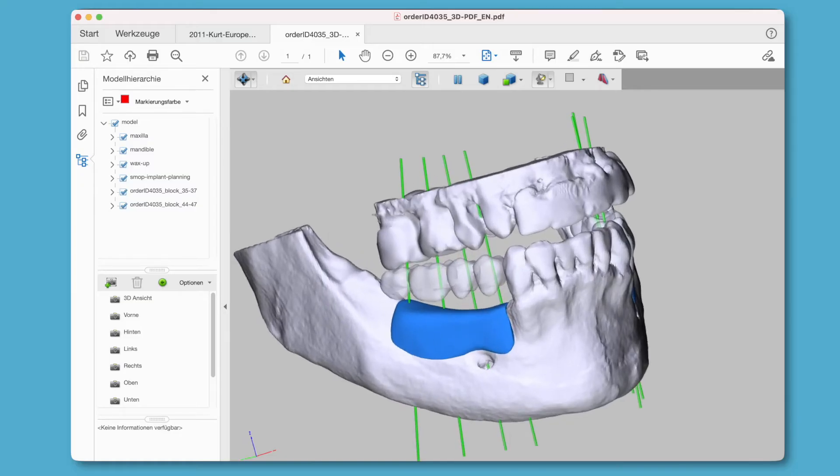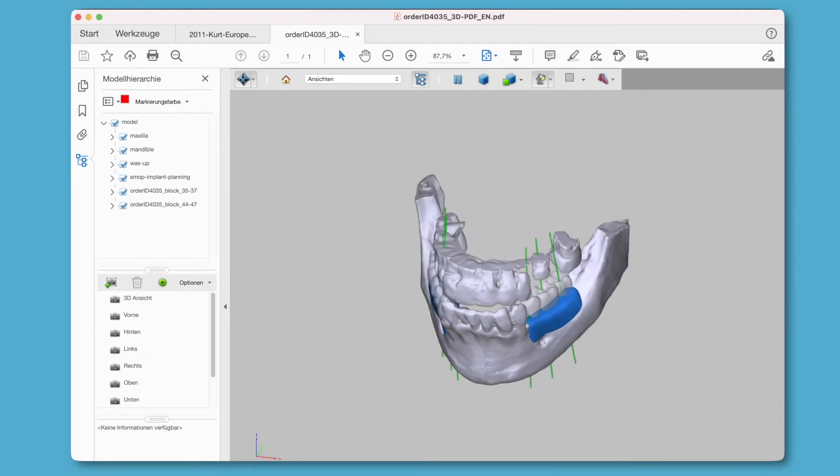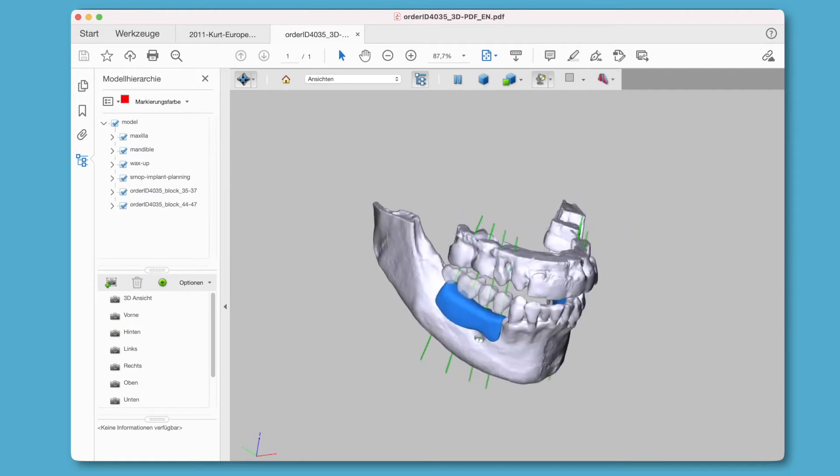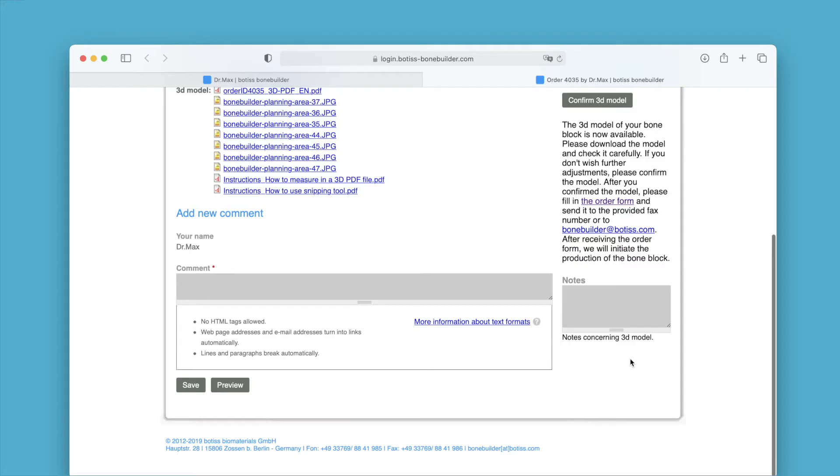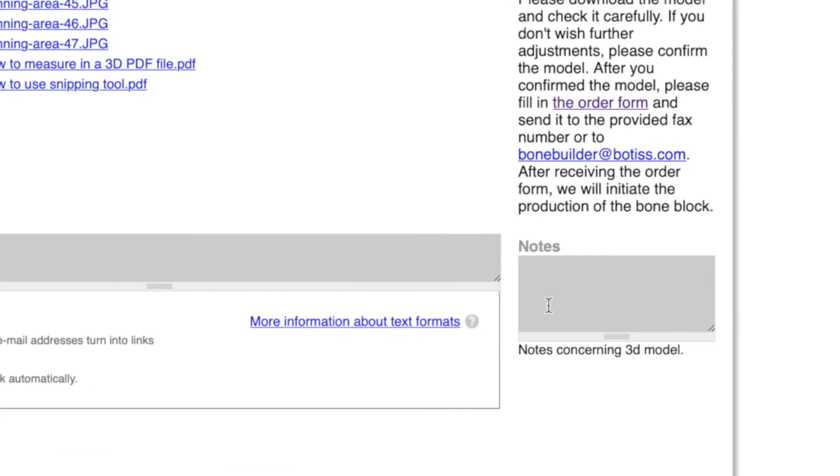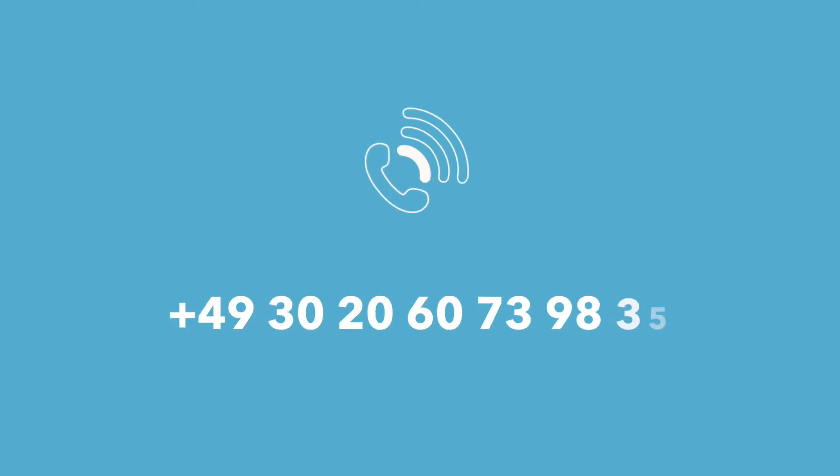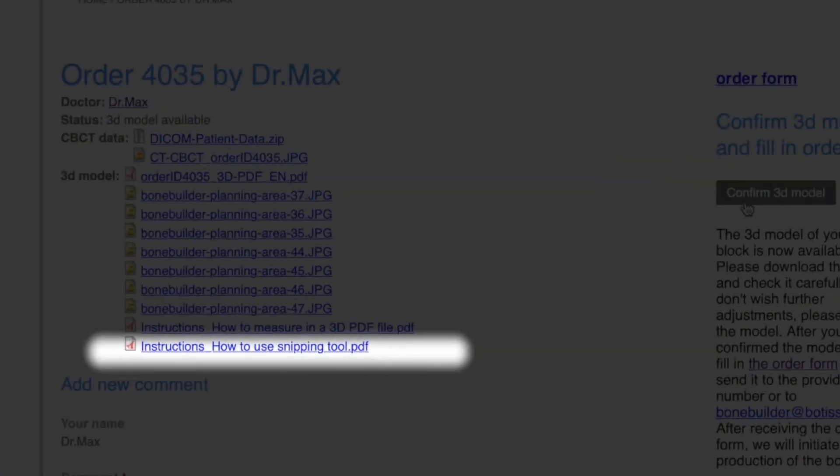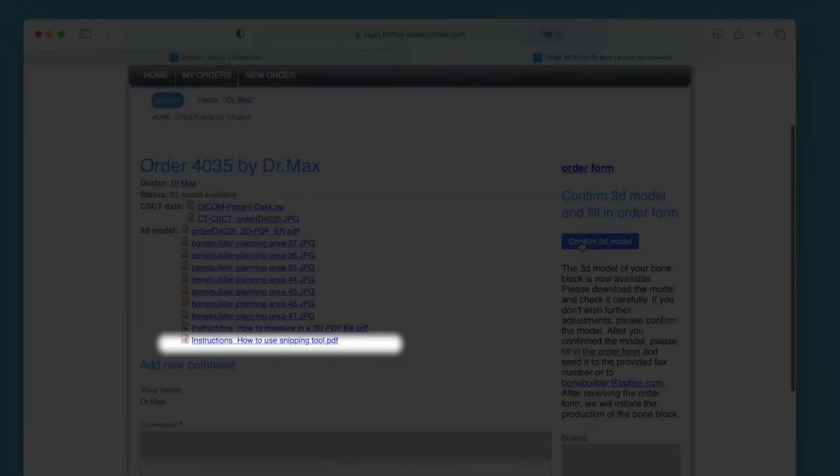The 3D PDF gives you the opportunity to check the proposed design. In case you have modification requests, you can send them to us via the comments section online or inform us by telephone. You can also show us your desired changes graphically and will receive a PDF to help you with this.